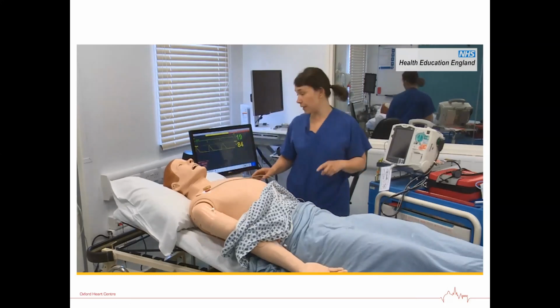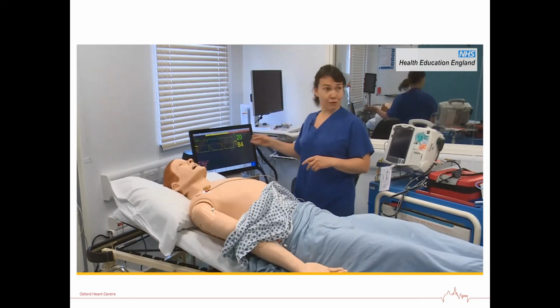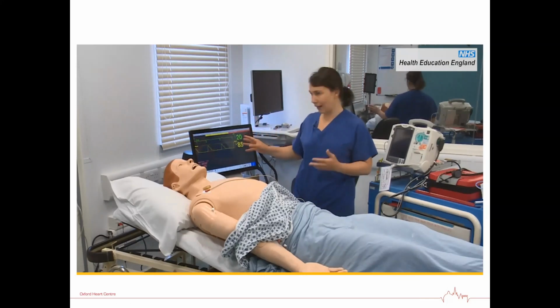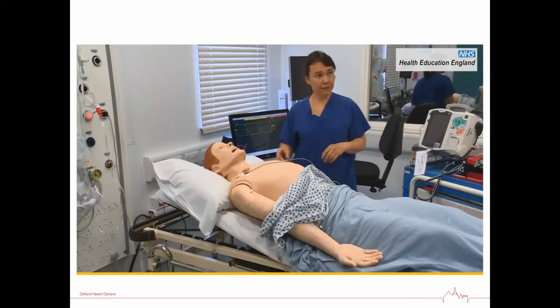Hi, I've got this patient, Mike Walker. I've just put him onto the monitor. His pulse rate's very, very low, looking a bit like block, and he's compromised in his blood pressure as well. Yeah, I think very good. Thanks for calling me.